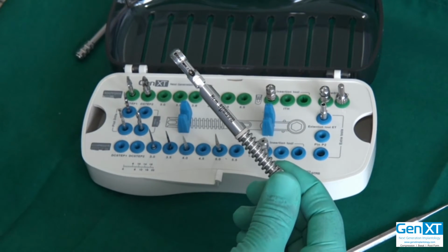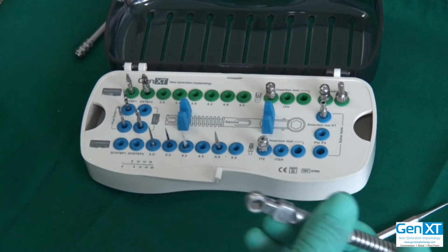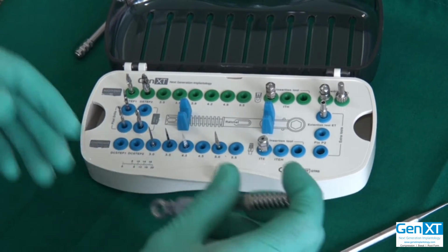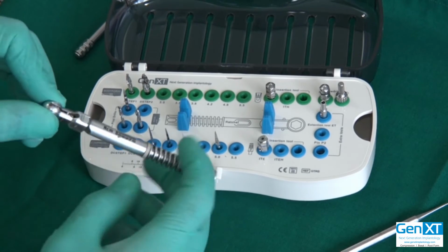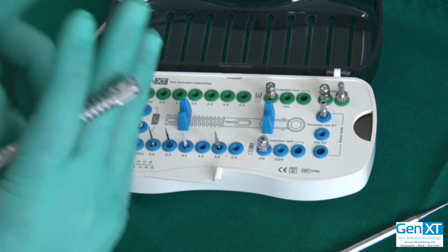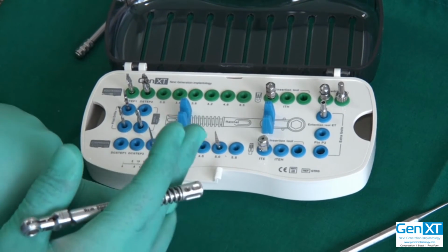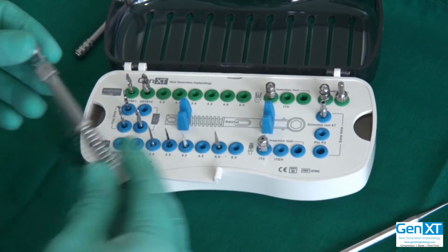You can save the implant mount or the provisional abutment, whatever you call it, at the time of uncovery to use it maybe as a gingiva former, or if you want to do a single stage technique, or you can use it as a transitional abutment, and then you can order the open tray transfers, and you can order the final abutment, and go ahead and do your prosthesis.